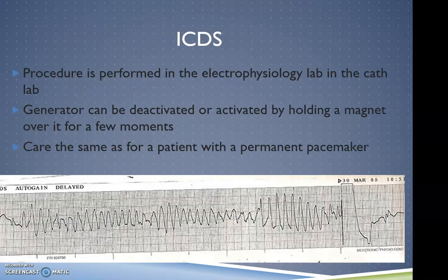This procedure is performed the same way as inserting a pacemaker. They are taken to the electrophysiology lab inside the cath lab, where the electrophysiology cardiologist will implant it. Care is the same as a patient that's had a permanent pacemaker. I'm not going to go through all of that again.